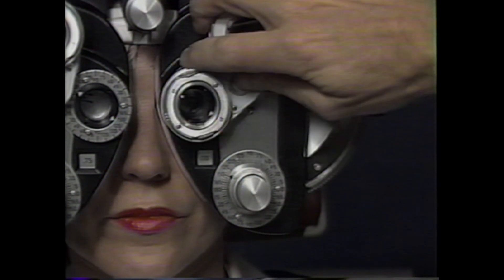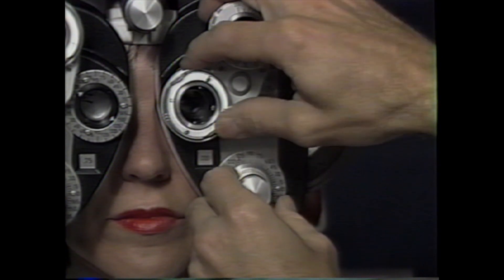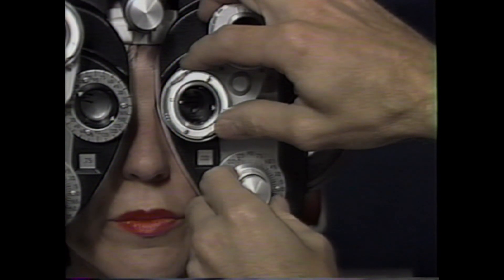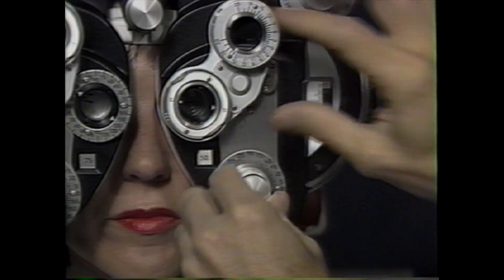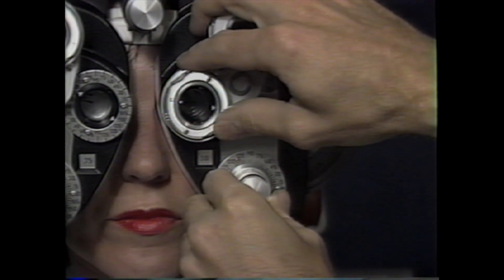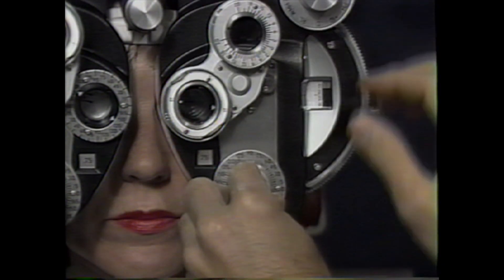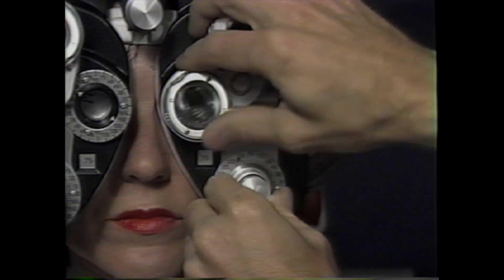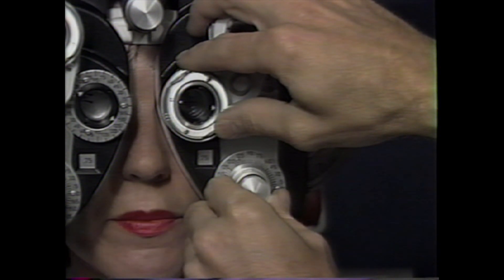Now I'm going to give you a choice. Tell me which is better. Number one or two? Two. Good. Three or four or about the same? Four. Okay. Five or six or about the same? About the same. Good.